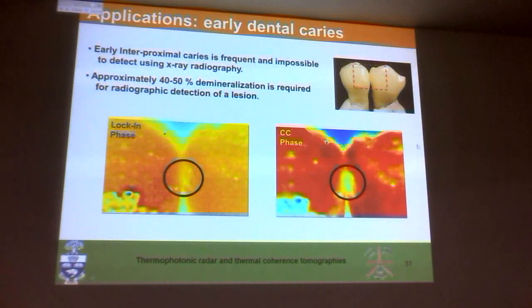And this was, again, where we started looking at the interproximal region. Here you have no interference. The interference is when the incident wave meets the thermal wave, and it has a peak at that position because that's where your response is. So you can move that delay time to pick up other absorbers above and below, so you don't have that integrated effect. So it's depth resolved as opposed to depth integrated, which is really the major issue here, because it's a diffusive field you're talking about.